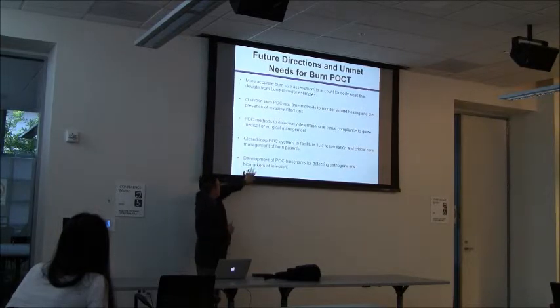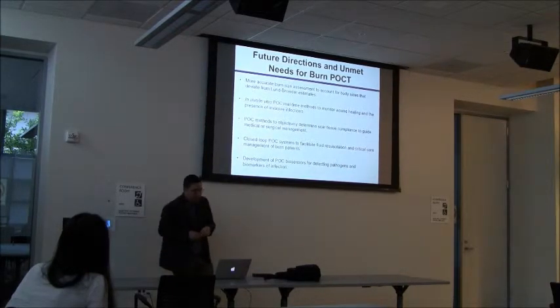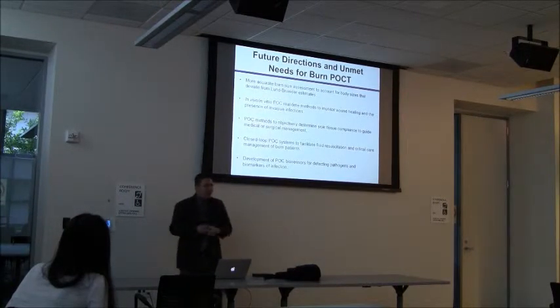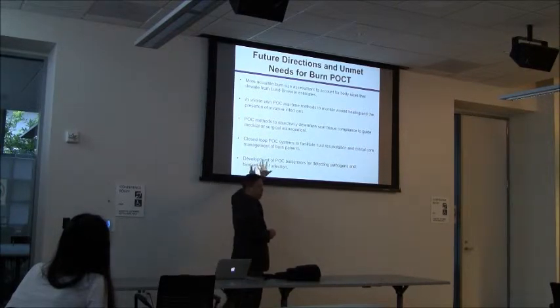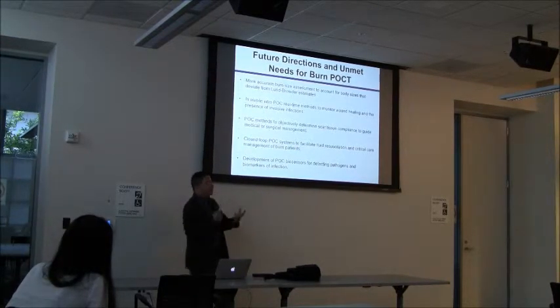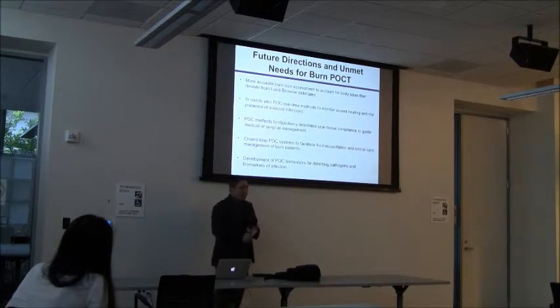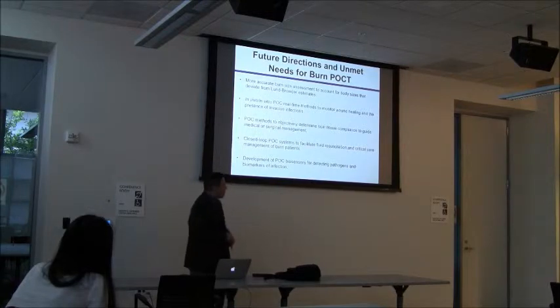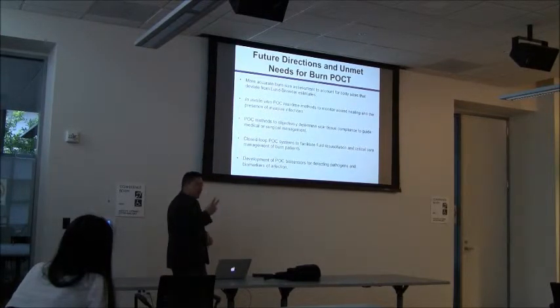We can. So lastly, development of point-of-care biosensors for detecting pathogens. We have PCR, but we need to make this smaller, more bedside capable. This is not just for burns. If you can do this, you will be rich beyond imagination because we need this in disasters, on the battlefield, in hospital clinics, and rural clinics all over the world because infections are still there. In fact, sepsis, I believe, is still the number 2 cause of death in the United States, second to heart attacks. So it happens a lot.